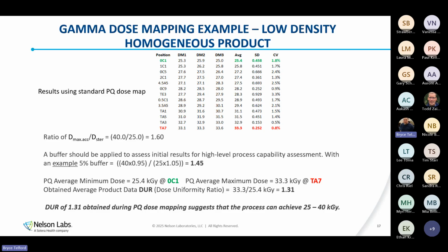So if I try lowering my dose, but my bioburden is too high, then I need to implement stuff on my end, such as tighter clean rooms, tighter controls, maybe even a cleaning process, which I now have to validate. All of that is going to add up over time into increased production costs.